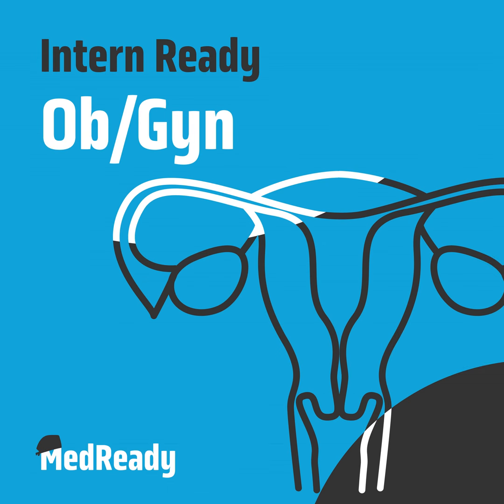Be prepared to get wet during a hysteroscopy, because it's always the case that the inflow and outflow ports have moments of dysfunction and it will just get everywhere. Using the under-the-butt drape as best as you can to catch all of the fluid as it's coming out can be super helpful for your scrub techs and your attending to make sure that we are calculating the amount of fluid that comes in and out of the hysteroscope correctly.